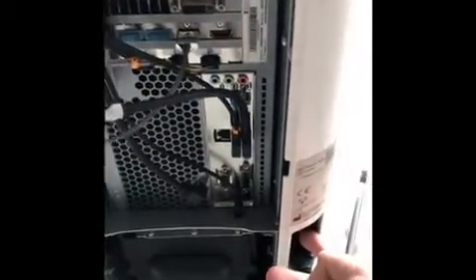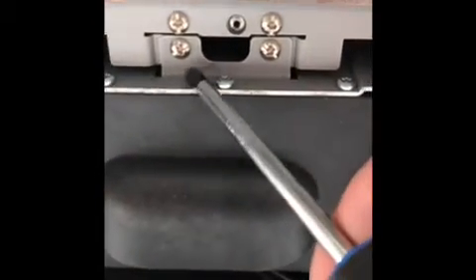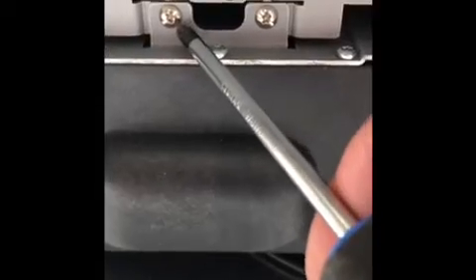To start, make sure the unit is unplugged and make sure the switch is turned off, that way there's no power going to the battery at all. Then these two little screws right here — that one and that one — need to be removed.